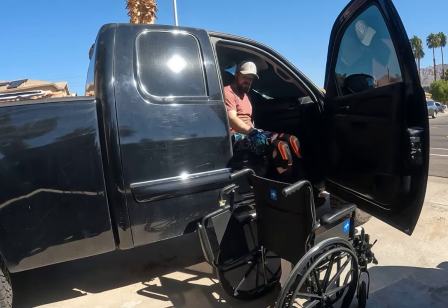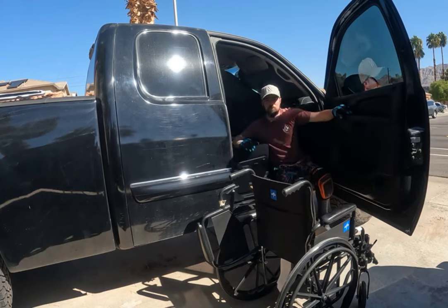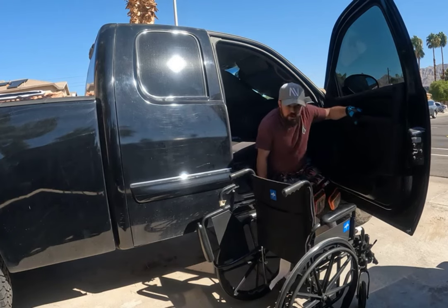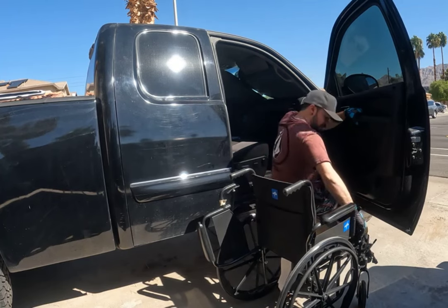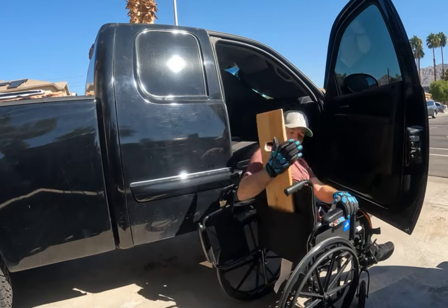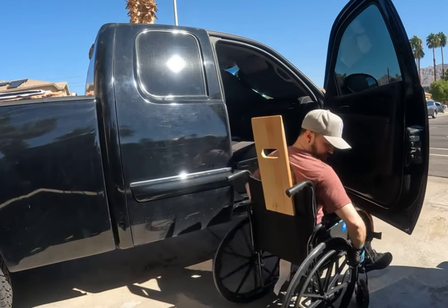To get down, I don't suggest going straight down because that's a really steep incline. What I do is come straight down to the floorboard first. From there I hold onto the handle on the slide board, make sure it's not going to go anywhere, and then slowly come across and just let it slide you down naturally.